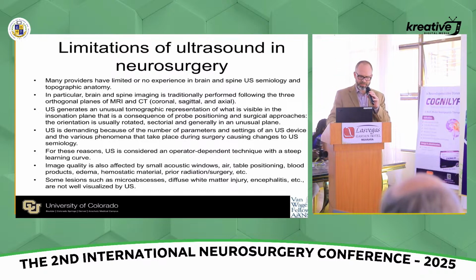It's demanding because you have a board with 100 different buttons, and that can be intimidating, but it really comes down to just a few key things that need to be adjusted. And there are some automatic settings.